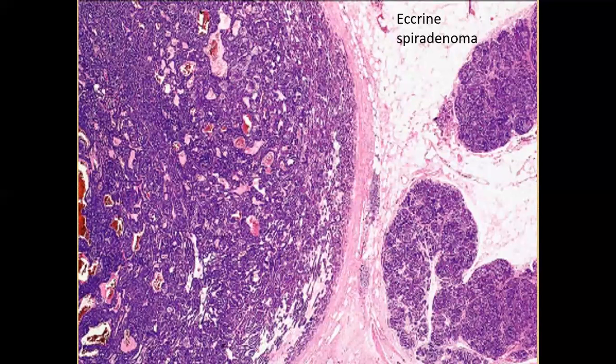Eccrine spiradenoma. It is one of the painful tumors of the skin, originating from the eccrine epithelium. There is a well-defined capsule, and again, there are two kinds of cells, the basaloid cells and the cells with eosinophilic cytoplasm.